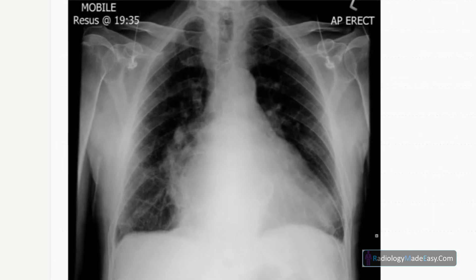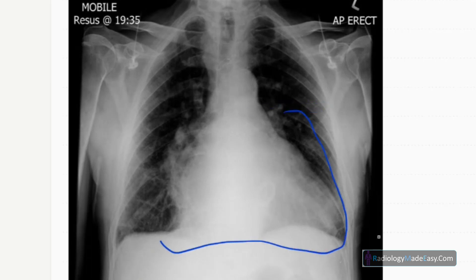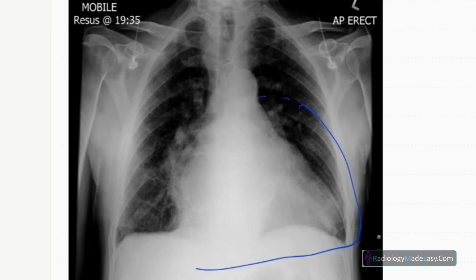Of a skeletally mature male patient. There are a few abnormalities. The obvious abnormality is cardiomegaly — you can see cardiomegaly is present. Apart from that, you can see a rounded opacity in the region of the mitral valve, which means this is a mitral valve replacement. So we can think that this patient has probably had mitral valve surgery for mitral stenosis.